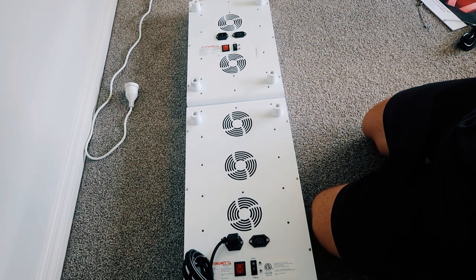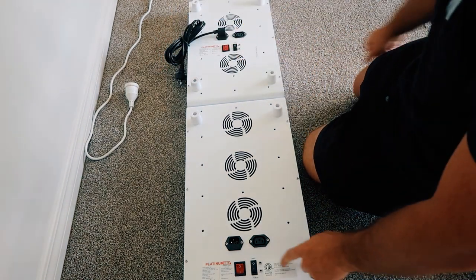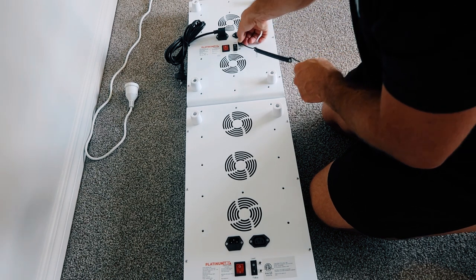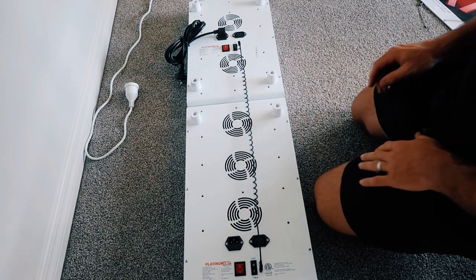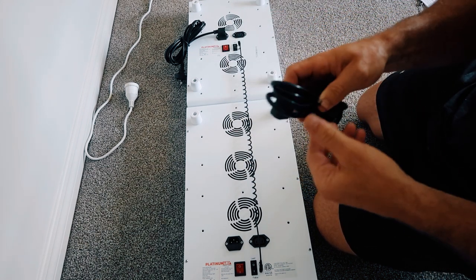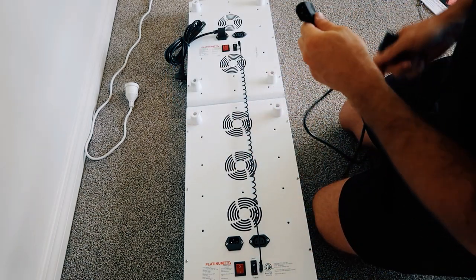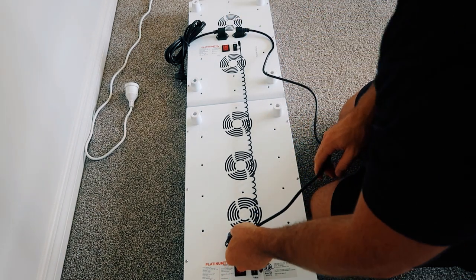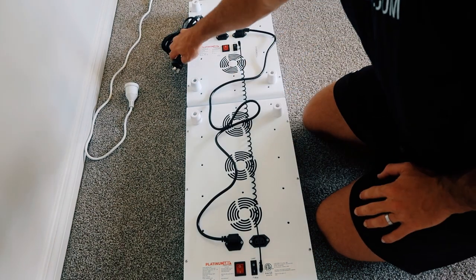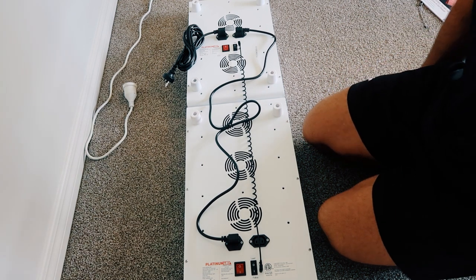I've laid this down on the floor to make it easier to show the wiring. I'm using the 450 as the lead unit — that's where the power cord goes — and I've set it to lead and the bottom one to follow. Now I'm connecting the 3.5mm adapter into the lead unit and then into the follow unit. Then I take the extension cable — it has a female end and a male end — plug one end into the 450 and the other end into the 900. Then I'd tie the cables together, plug into the wall, turn both units on, and fire it up.